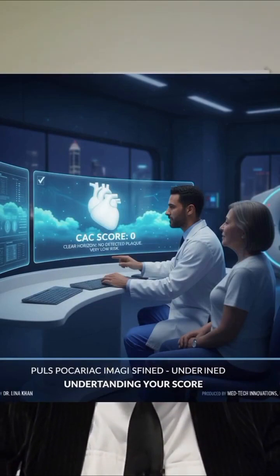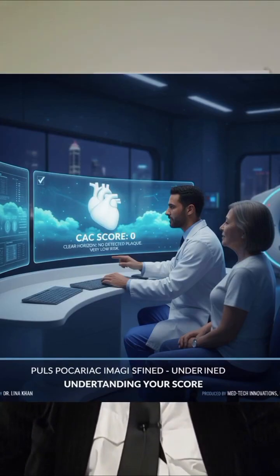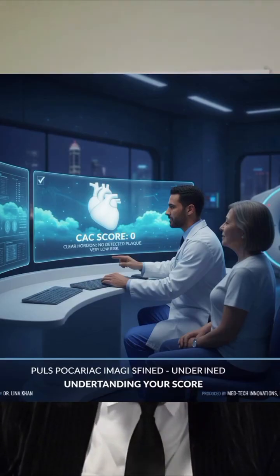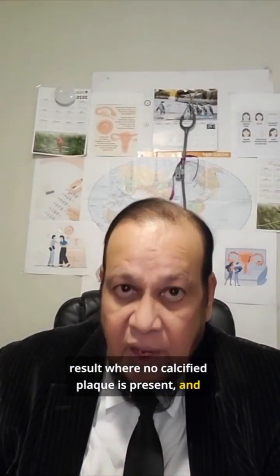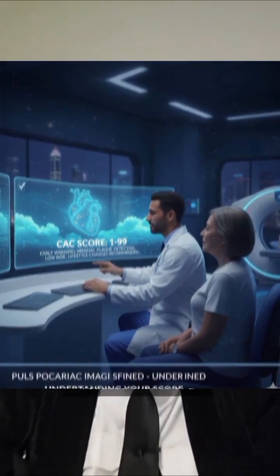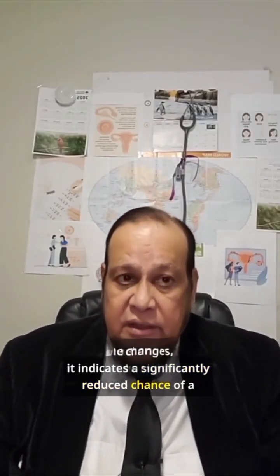A score of 0 is the best. In this scenario, there is absolutely no calcified plaque present within the arteries, and it clearly indicates that you have a very low overall chance of experiencing a heart attack. Furthermore, a score ranging from 1 to 100 shows that there is only a minimal amount of plaque buildup, while the risk of developing heart disease remains relatively low.